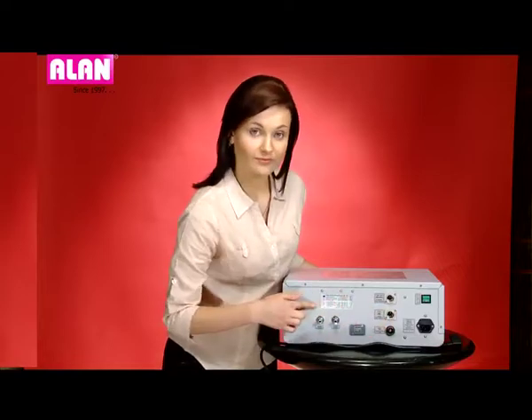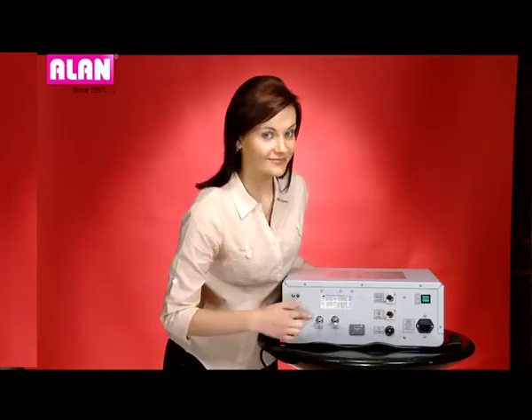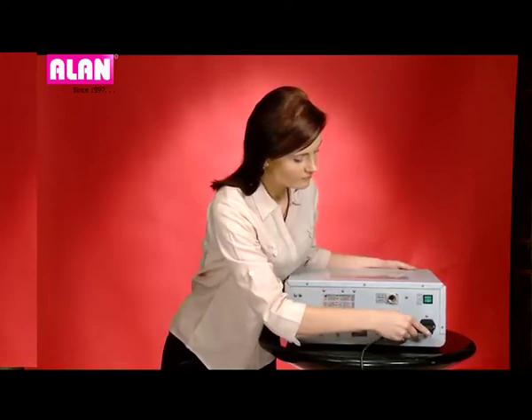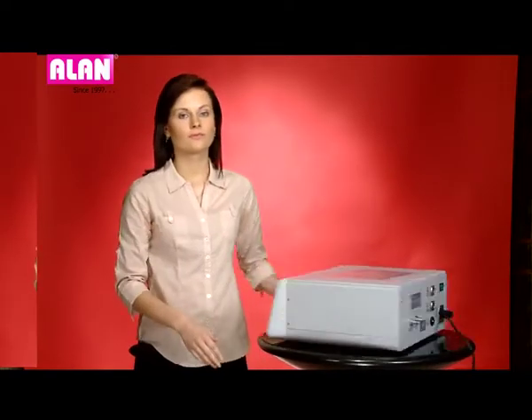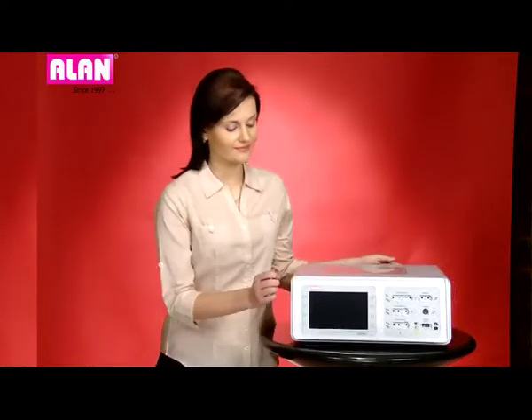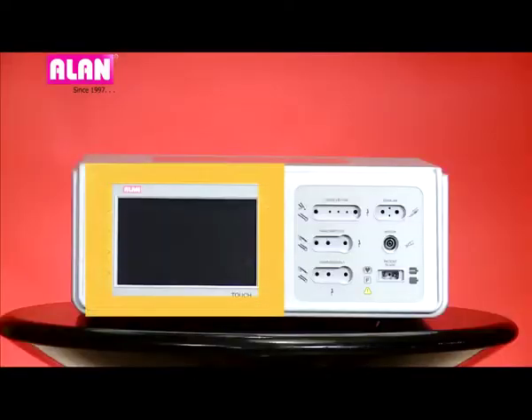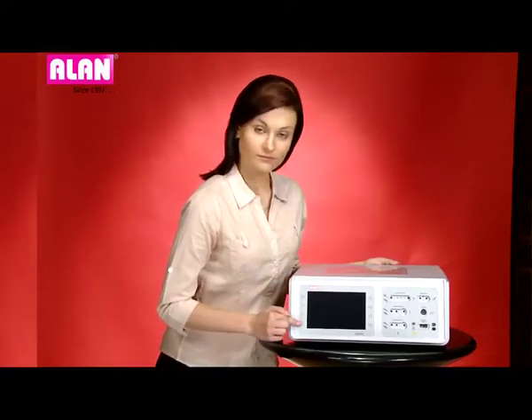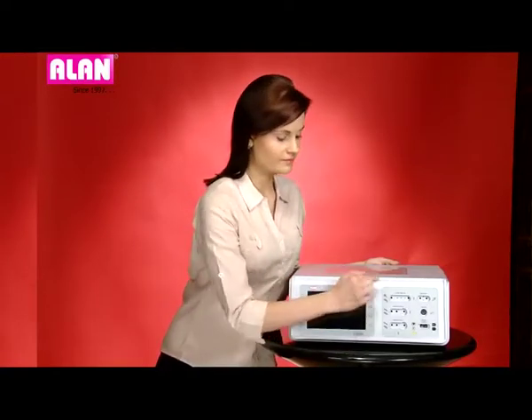This is the argon input. We have dual argon input for redundant operation. In the front we have a 7-inch touch screen, feather touch keys on both the sides of the screen and output ports.